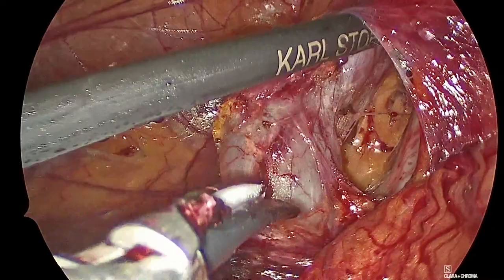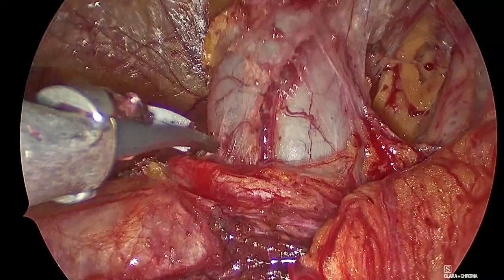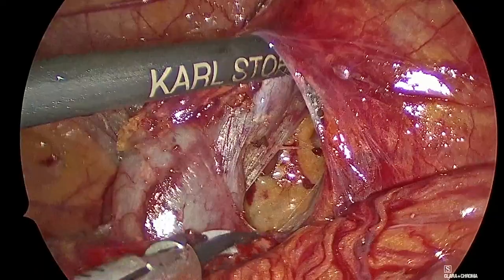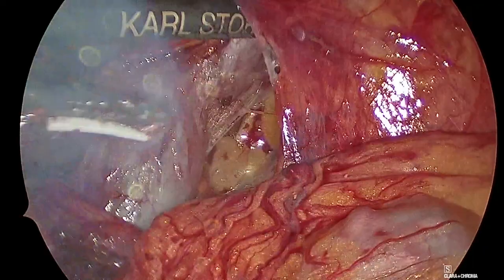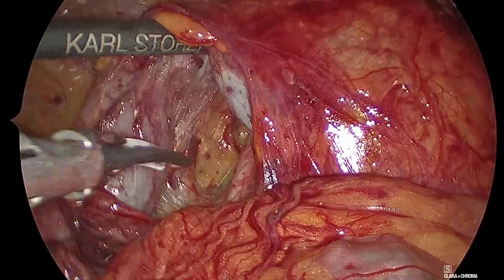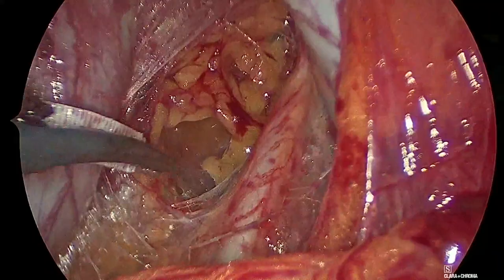Let me check, because it looks like there's an artery here, which probably is the gonadal artery, but we will see. So you see the renal pelvis is having this tortuosity that we were looking already at the CT scan. Okay, so now we are going in. Come in. Viente adentro, Luis, por favor. No demasiado.